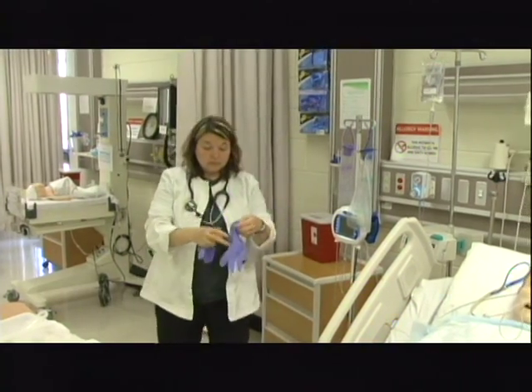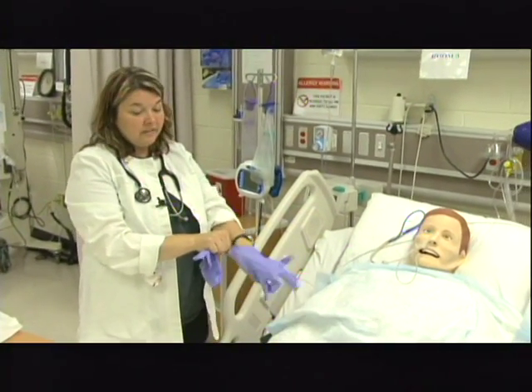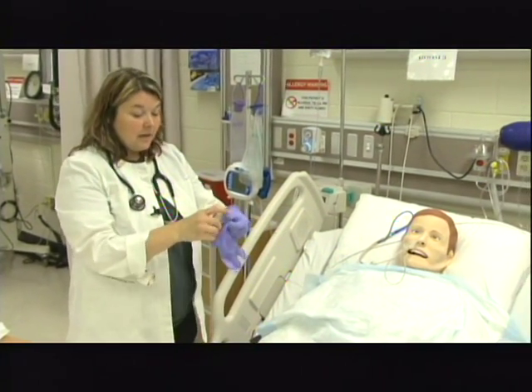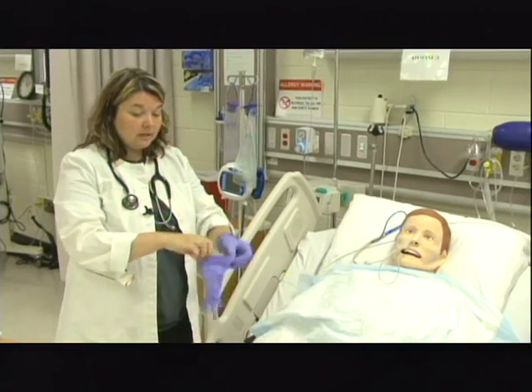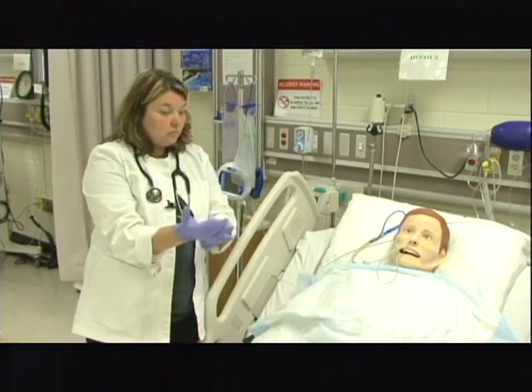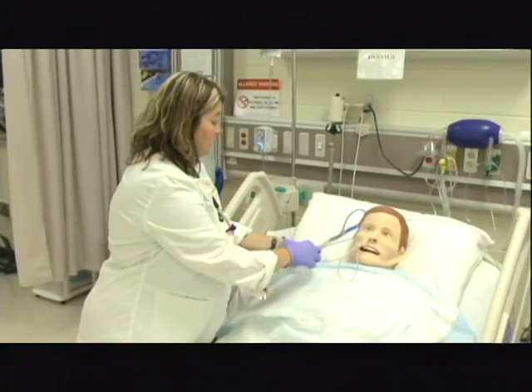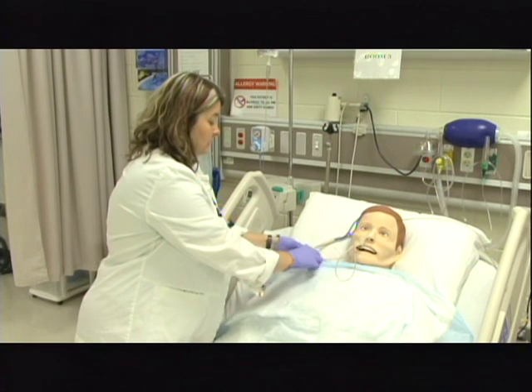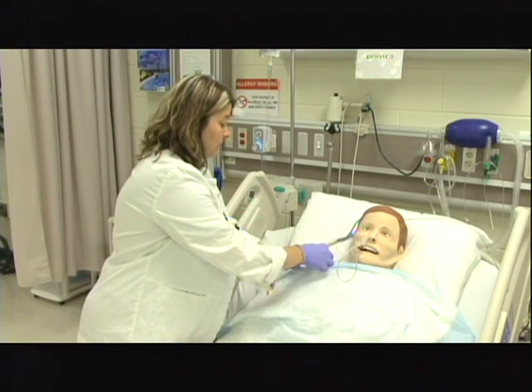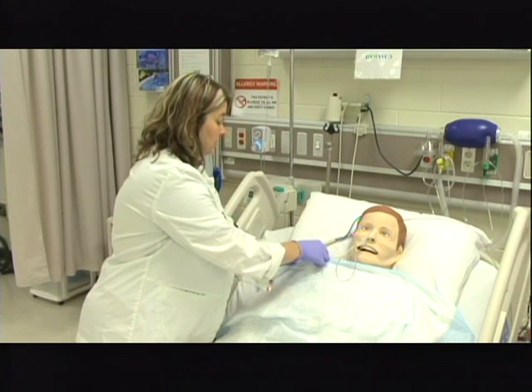The next thing I need to do is, anytime I come in and manipulate an NG tube, feeding tubes, any of that kind of stuff, I need to always make sure the first thing that I do is confirm placement. So, the first thing I'm going to do is measure the tube. Please remember that the chest x-ray is always the most accurate way to confirm placement, but they're not going to do that every time that you're manipulating the tube.